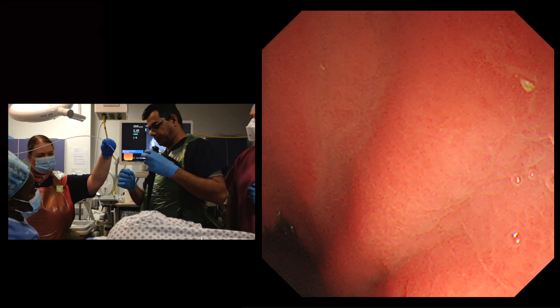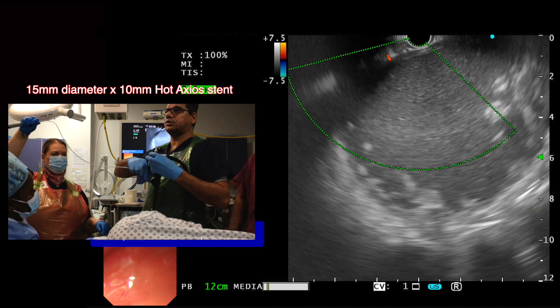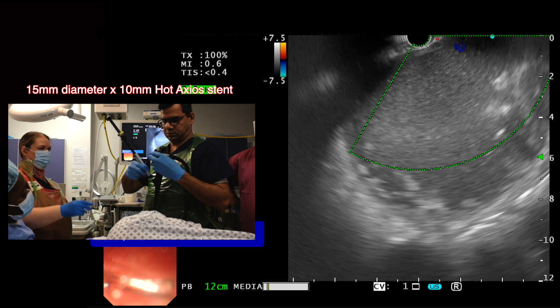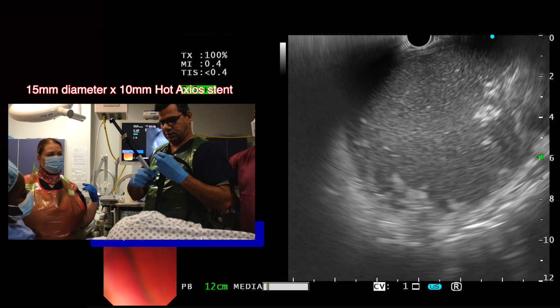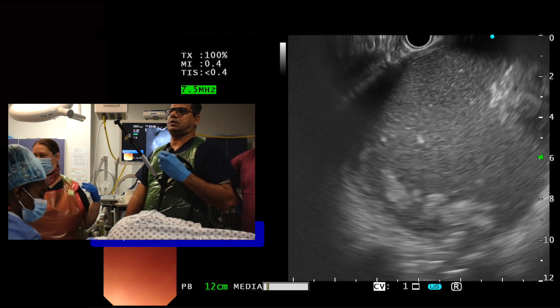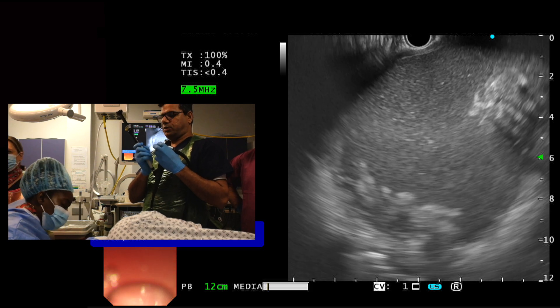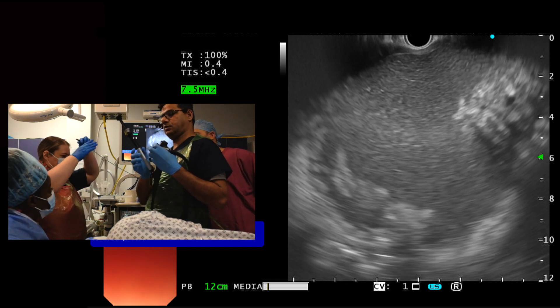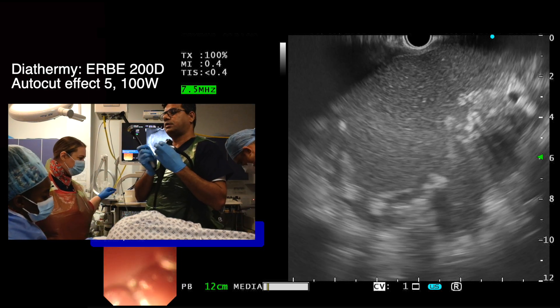Let us now return to the case. We see the endoscopic view with the bulge visible on the posterior wall. The hot Axios catheter is lubricated with water and passed down the channel of the scope. The lever lock is used to securely attach the handle to the channel of the scope. For this case we used a stent which had a diameter of 15 mm and a saddle length of 10 mm. The diathermy cable is attached to the Erby 200D diathermy unit set at AutoCut mode, effect 5, 100 watts.